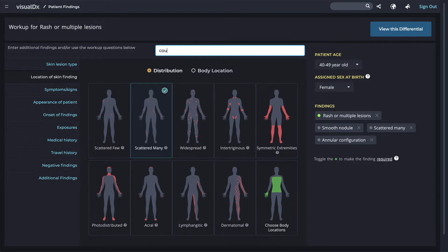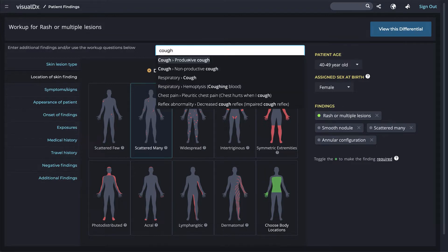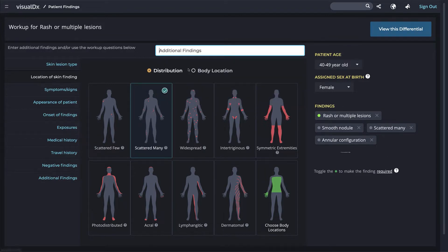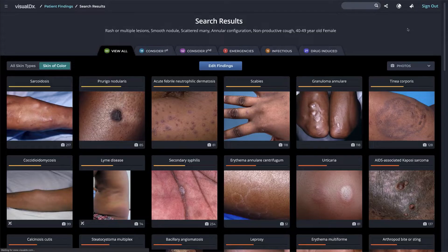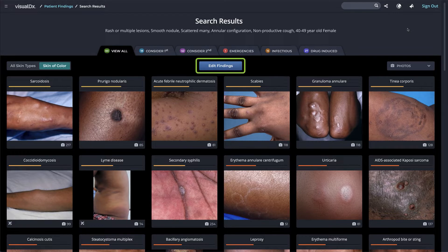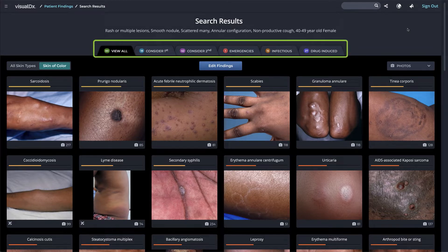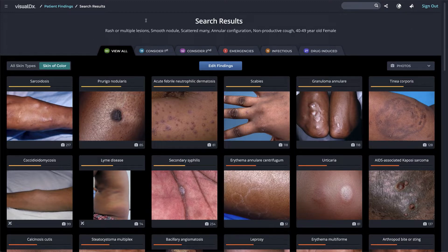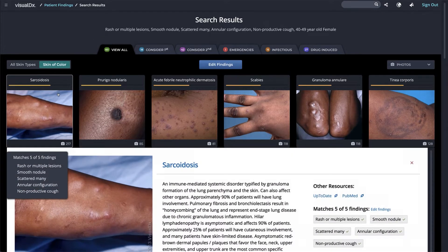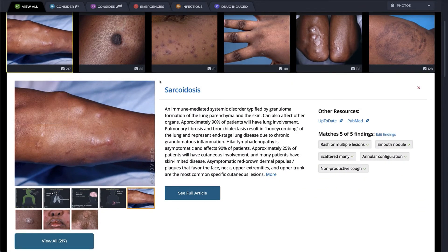Then we'll type in annular configuration and cough. The type-ahead anticipates your findings — notice that you can choose different types of cough. You can view the differential at any time by clicking the 'View This Differential' button, and you can edit findings easily. VisualDX breaks down the differential results into six simple categories. Thanks to VisualDX, the patient in this case study was accurately diagnosed with sarcoidosis.